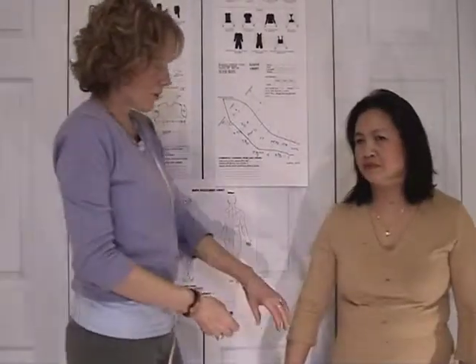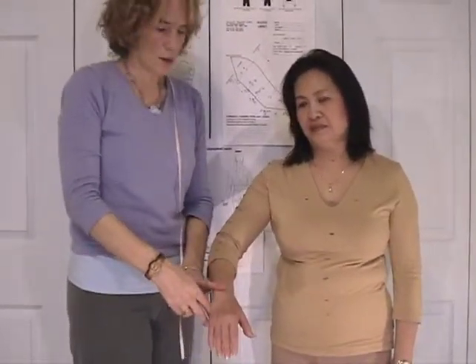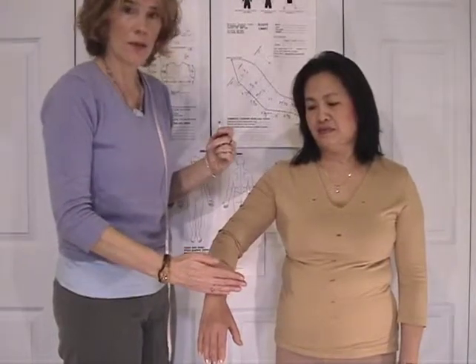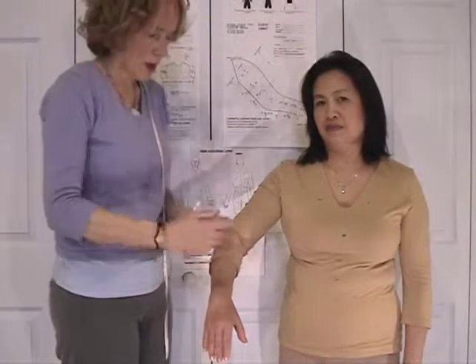Another important consideration for sleeves — and this goes for legs as well — is that you always have proper overlap. For example, if you've measured a sleeve and the patient will also have a glove, the sleeve needs to end right at the wrist bone and the glove should come up two inches proximal to the wrist bone, giving a good two-inch overlap. With movement, garment length changes on the arms, so you must always ensure coverage with no gap between garments. Those are all the things you need to know for measuring the sleeve.